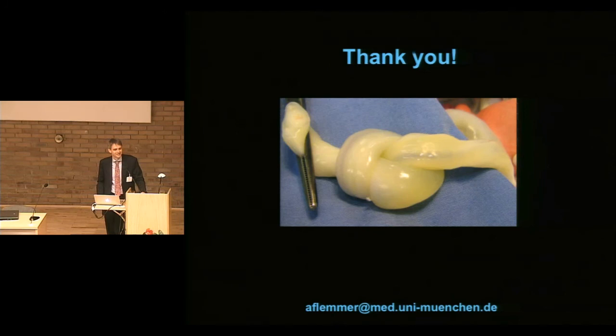Sorry, I was just saying that the umbilical arterial catheter is a very useful vascular access. If you need it, I've been very comfortable in the past to use it to give antibiotics and intravenous infusions or 10% dextrose maintenance fluid, and you can use that for several days. Inotropes, not so much. But that's with the tip in the high position. I think that might also be a difference. If you have a low position, then the dilution of your medication is probably a little less.